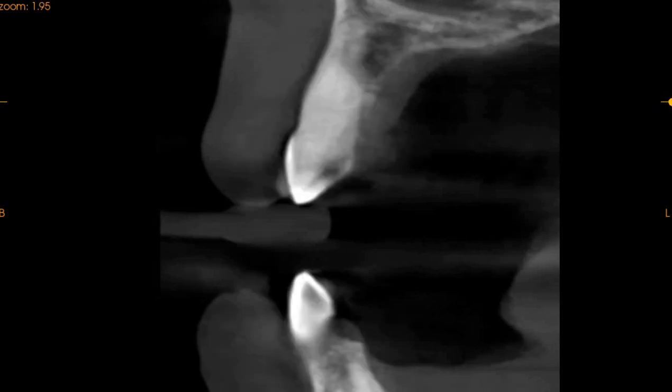This could be the reason for her extreme pain. She might be showing signs of irreversible pulpitis, and here we can see that the cavity has invaded into the nerve space.